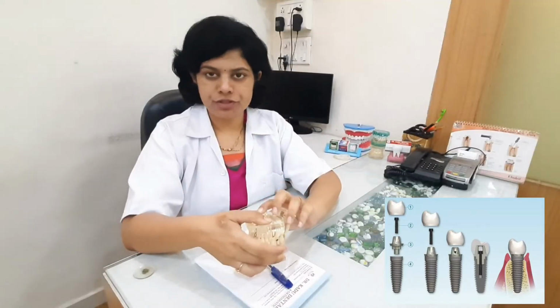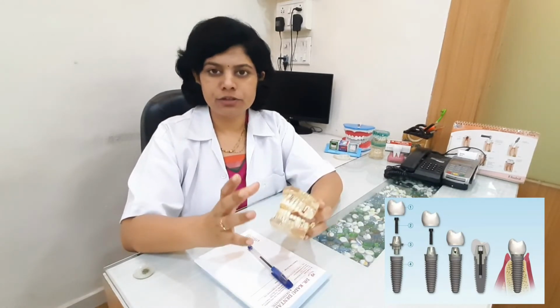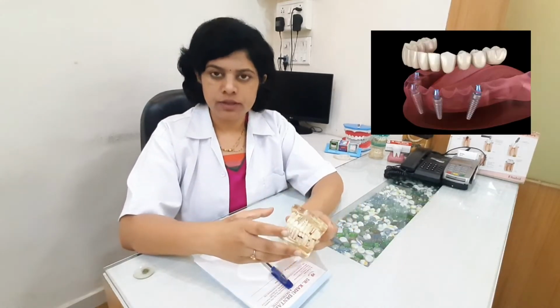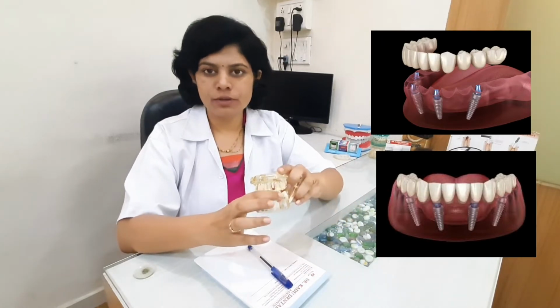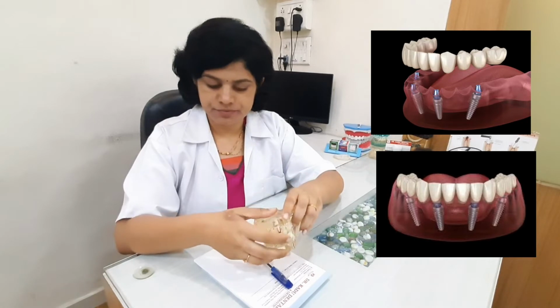And in an old age patient, when all the teeth are missing, we have to put a few implants depending on the condition of the patient's bone. We decide whether we need to put 4 implants, 6 implants or 8 implants in the lower as well as in the upper jaw. And on top of that, a denture will be placed.